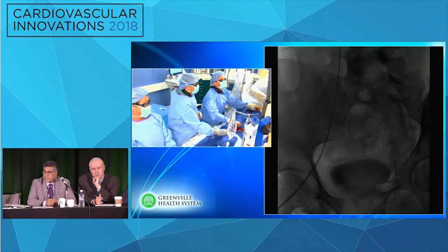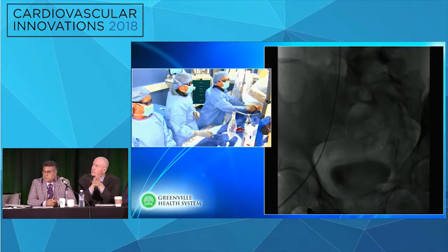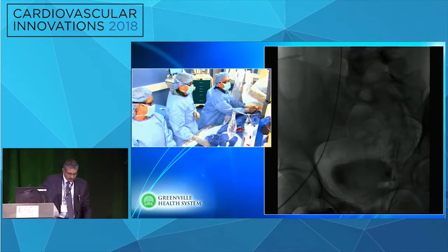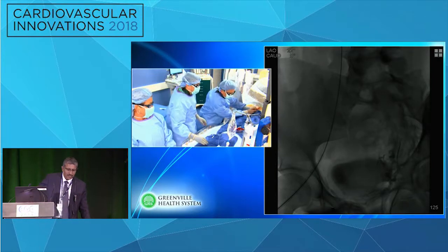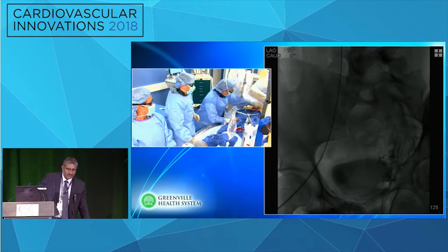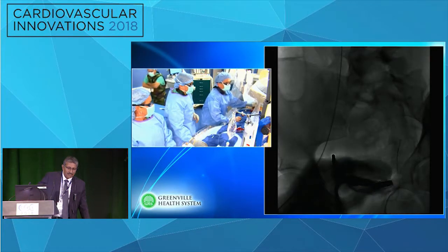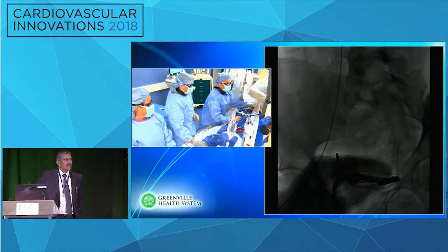Anyone for transcutaneous ultrasound here? I think that would be something I would suggest. Bruce, is there any chance you would consider that, or are you so experienced with doing this? An ultrasound probe right on the skin, transcutaneous ultrasound right here to guide you. Yeah, we did use ultrasound access. We got it right here. And for the life of me, it looks exactly like we stuck the common femoral vein. We are in the common femoral vein, that looks like right there.